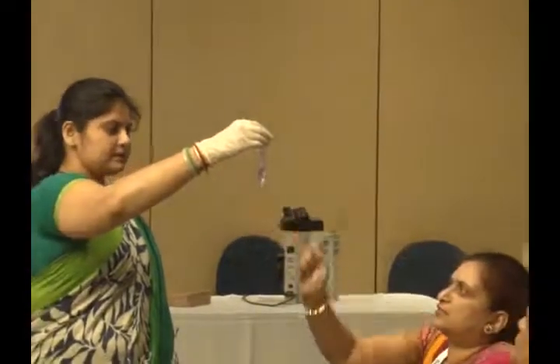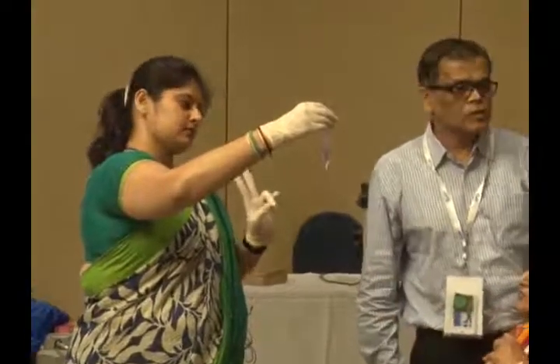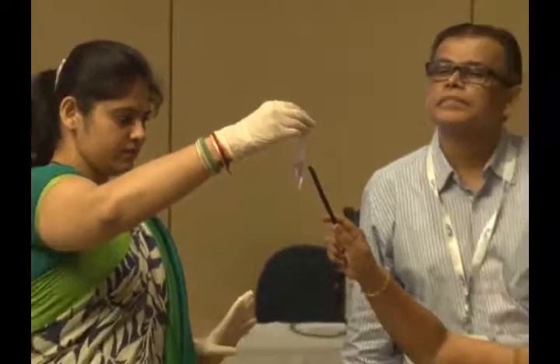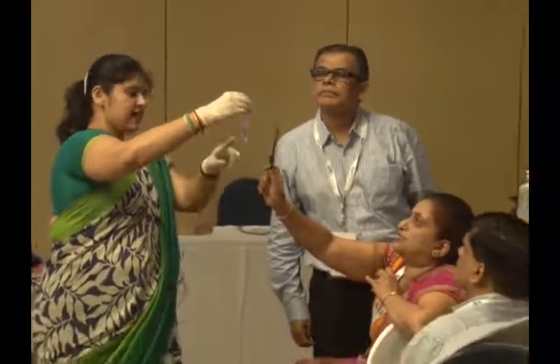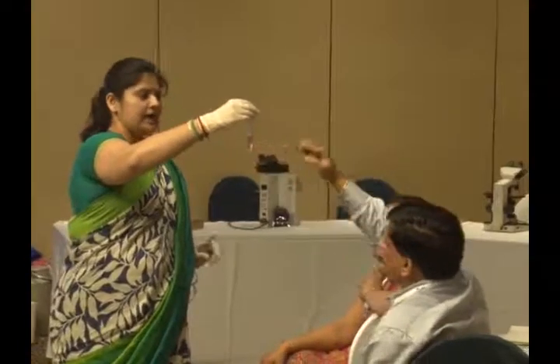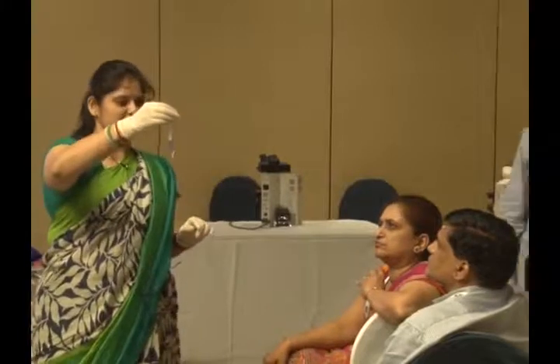This is the frozen sample, and it is prepared with the medium, so it is pinkish in color.